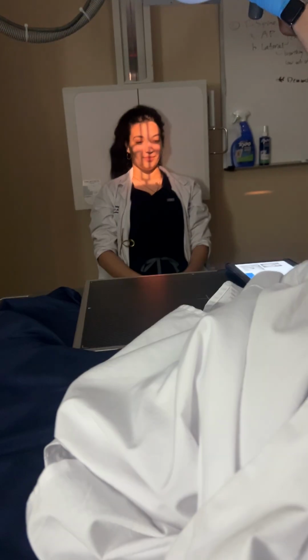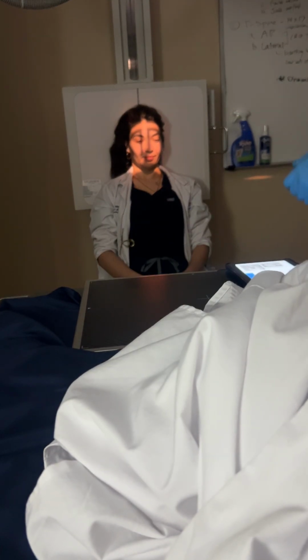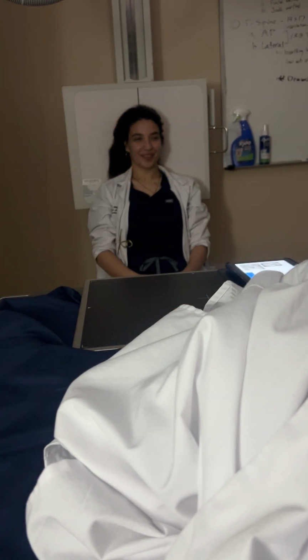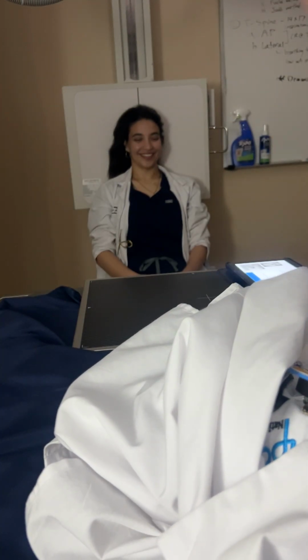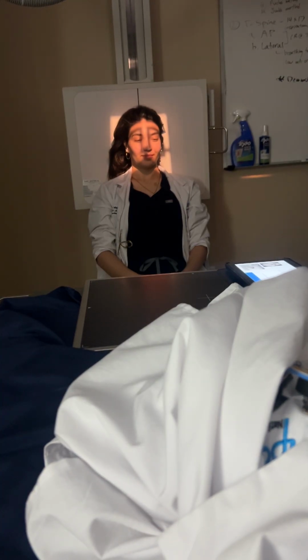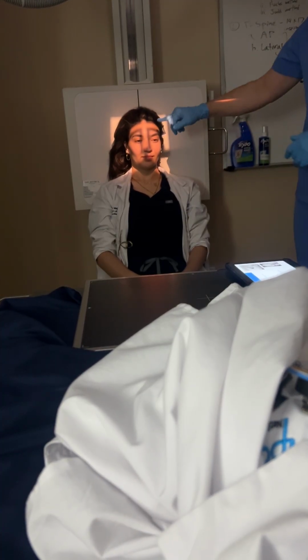Centering at the level of the what? The central ray is at the glabella, or 2 inches above the glabella. Basically at the hairline on most people. Okay, so let's say we did the IOML, 37 degrees. IOML is perpendicular to the board, 37 degrees angulation because I'm using the IOML, centering 2 inches above the glabella.